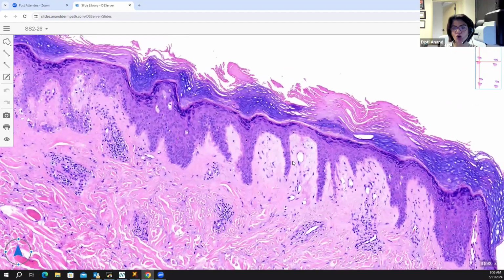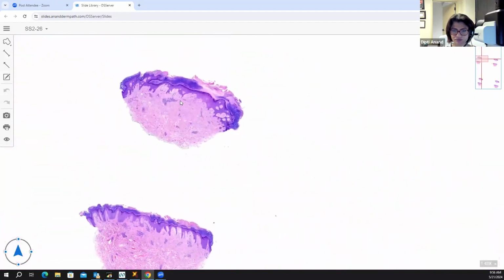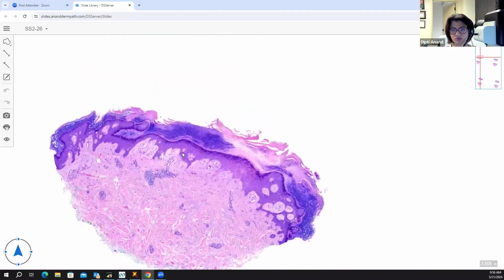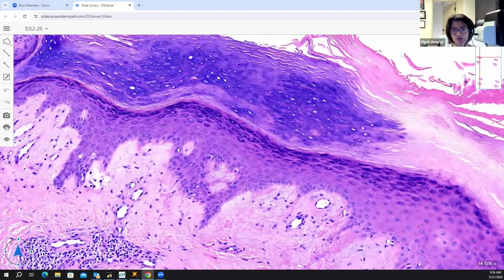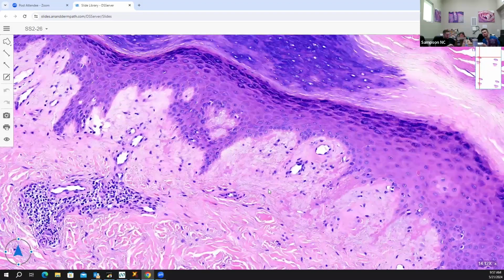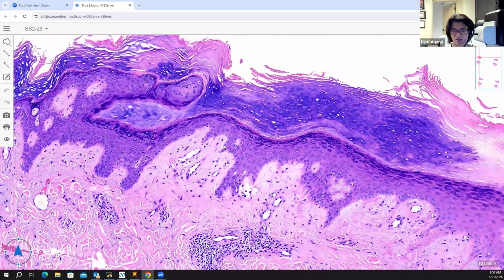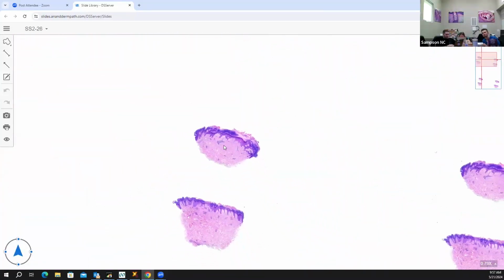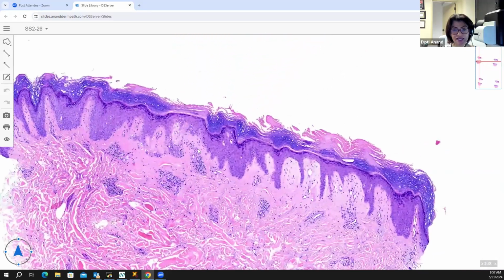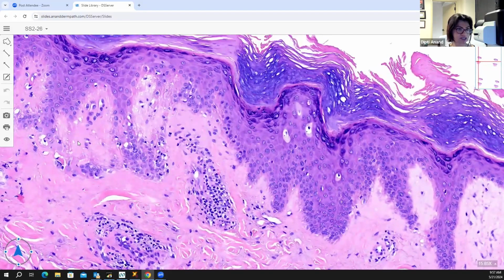There's some lymphocytic infiltrate. Tell me one thing. If this is acral skin, what do you think about the thickness of the epidermis, of the stratum spinosum on the acral skin? It's really thin. Exactly. What produces a thin epi on the acral skin with this kind of fuzzy amyloid you are describing is actually a fuzzy basement membrane.